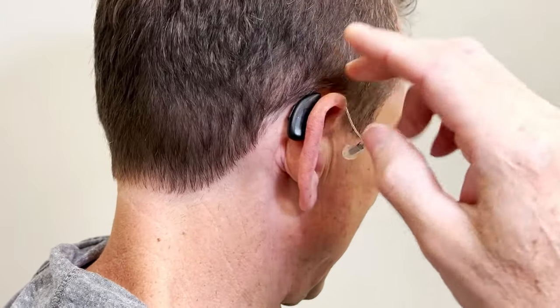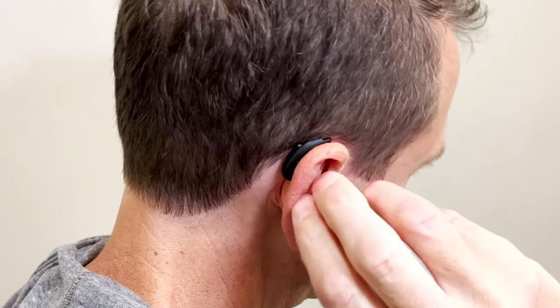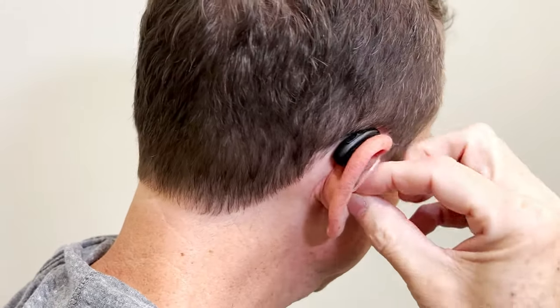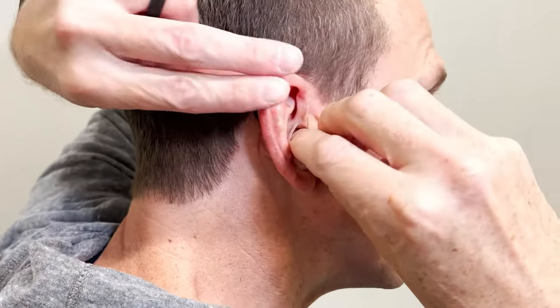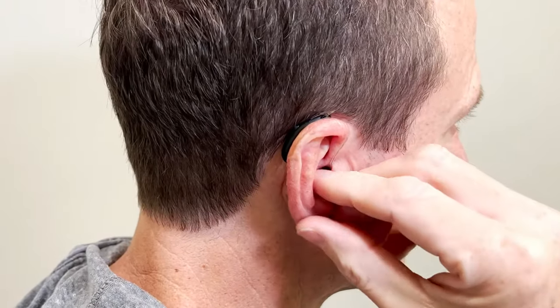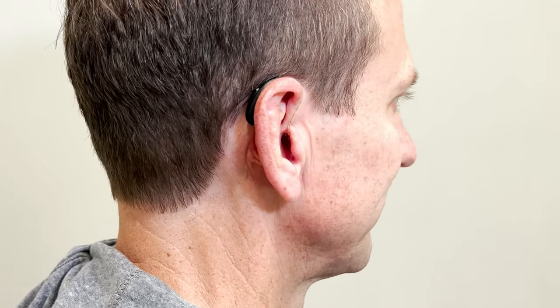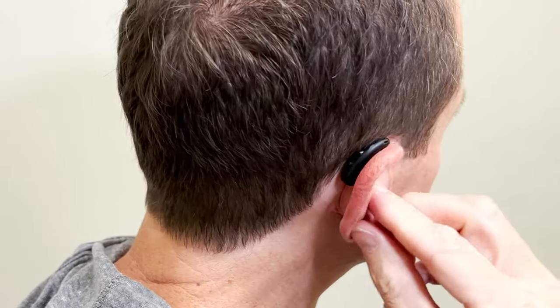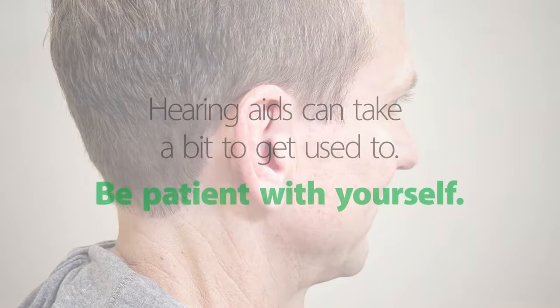To put on a hearing aid with the dome, place the aid behind the ear and gently position the wire in front of the ear. Push the dome into the ear canal — it may help to gently pull on your ear to open the canal. If your hearing aid has a retention anchor, tuck it into the bowl of your ear. To remove, simply reverse the process.